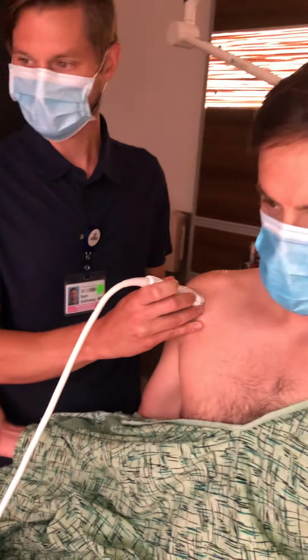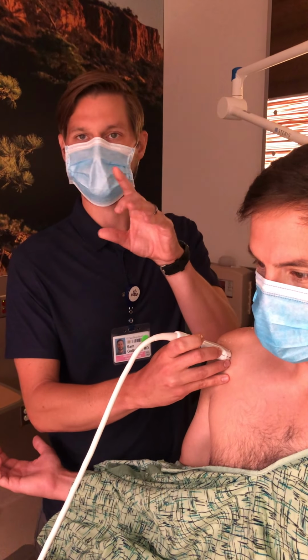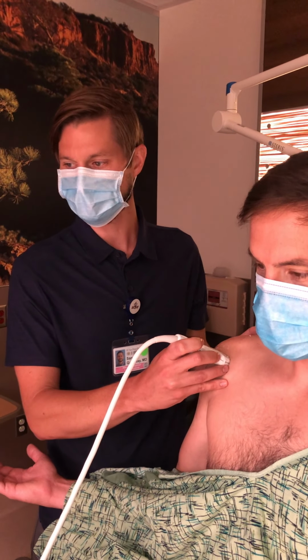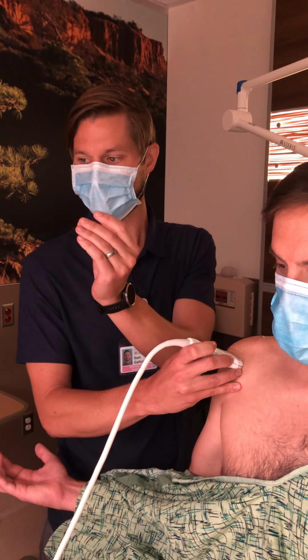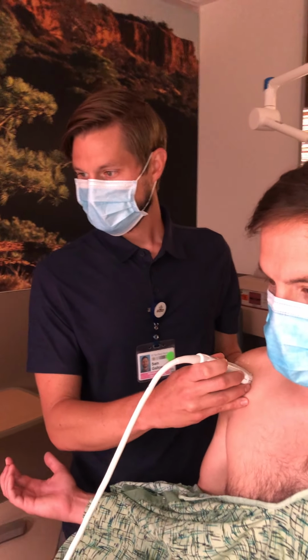Correct. Okay. And what you're looking for here is any evidence of disruption of those normal fibers. If it just looks more heterogeneous, sometimes you get some hypoechoic lines within the tendon, looking for either a tendinosis, or you can actually see if you had a full thickness tear, you'd see a dark hypoechoic or anechoic line, and then you'll see separation of the fibers. Okay, so you're looking for a full tear or even a partial tear on them.